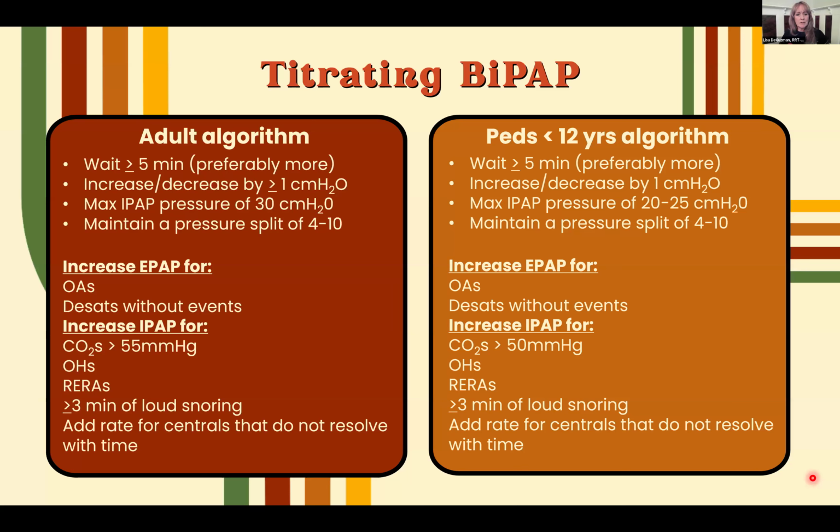BiPAP, pretty much the same thing. BiPAP comes in if they're not tolerating high CPAP pressures, you can transfer them over, or if we need to deal with hypoventilation and help move that CO2 out. So basically the same increases.